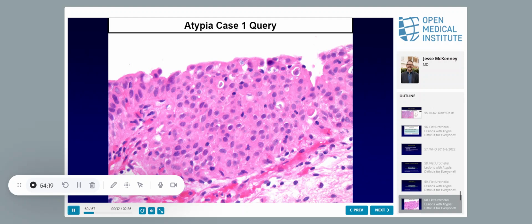So this is what some people call dysplasia. Okay? And I can tell you what a lot of people call dysplasia is CIS. But this is what we're really talking about, these lesions that are short of CIS. I don't know what this is. Could this be flat, like really early low-grade neoplasia? It could be. I don't know. Somebody did CK20. Look at that. What does that mean? I don't know.